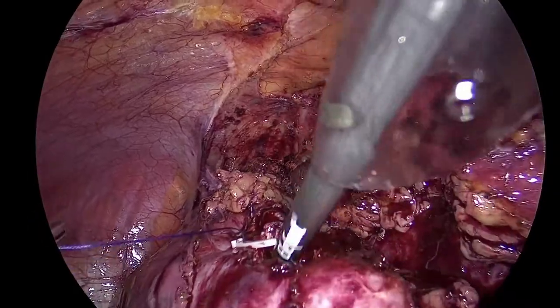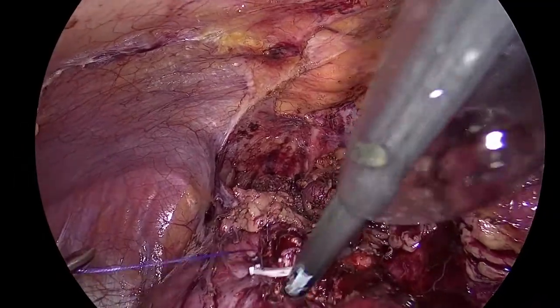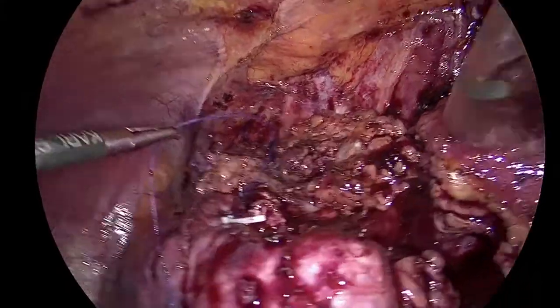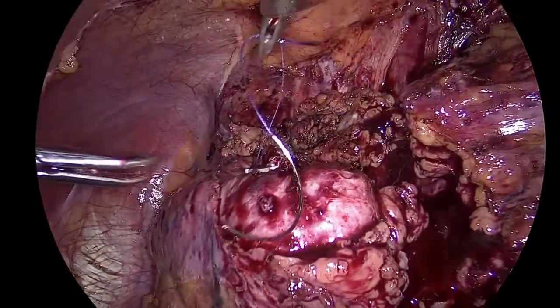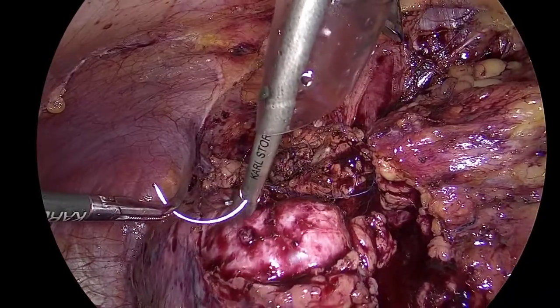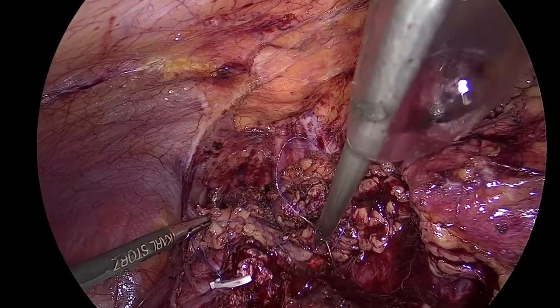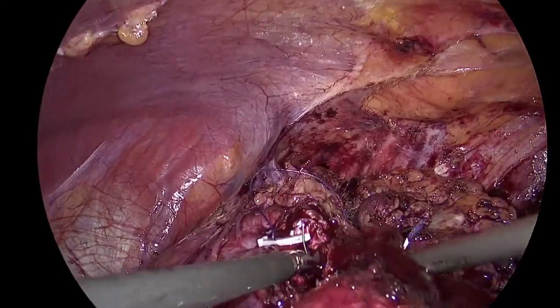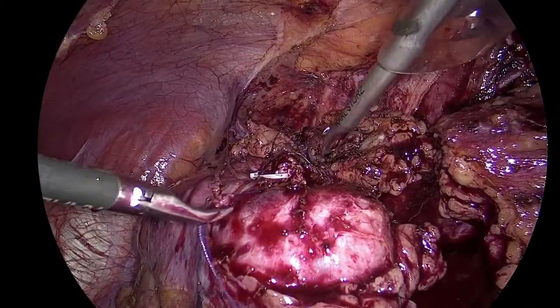Bring the pressure down to 12, please. Yeah, the pressure we have inside is 9 anyway. Give me a needle holder. Okay, show me. Go back. Now this is common stuff, what we do always. Come closer. Good. Clip. Go back. Show me here.